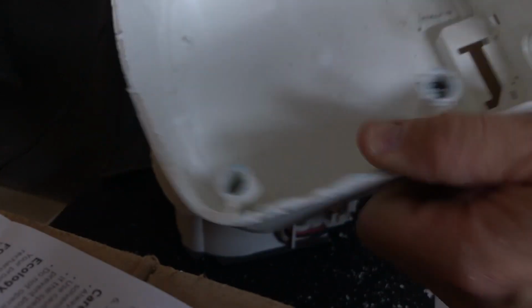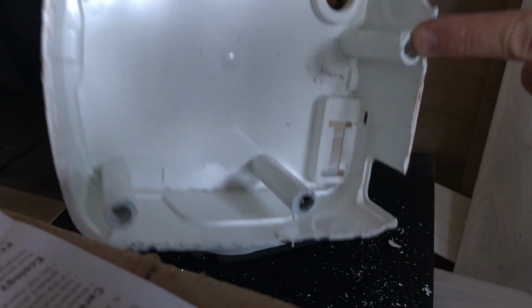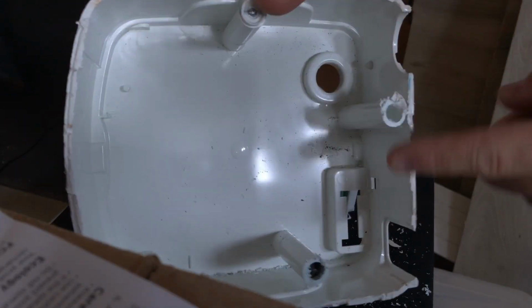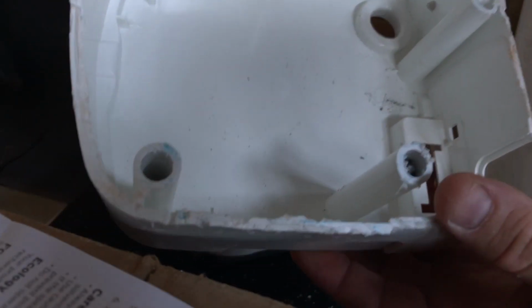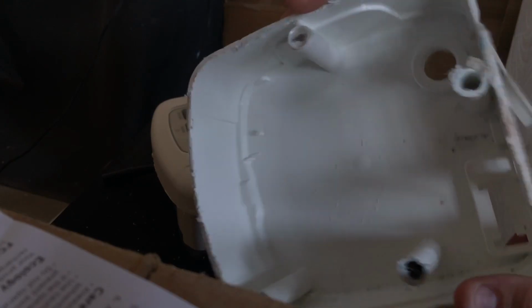There we go. Jeez. Yeah, so you can see how deep these screws went. There are only 1, 2, 3, 4 here. I tried to drill them out and didn't have any luck. They were quite deep in there. And I tried to saw them, still had no luck. But anyway, that's garbage. Okay, so let's see what we have here.